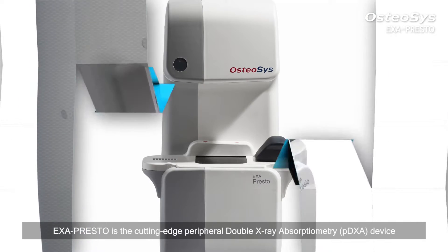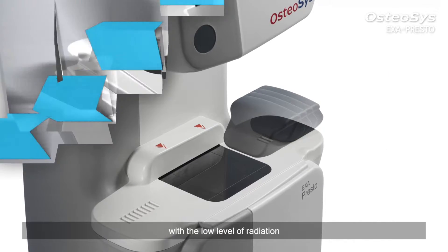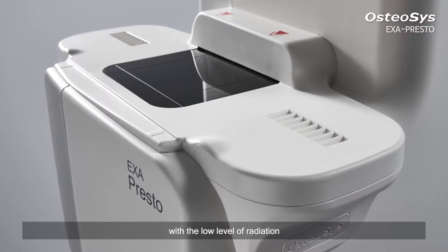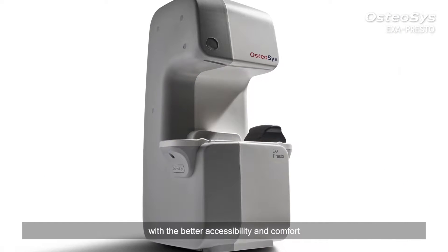Exapresto is the cutting-edge peripheral dual X-ray absorptiometry device with a low level of radiation. It is specially designed for an easy and swift diagnosis of osteoporosis with better accessibility and comfort.